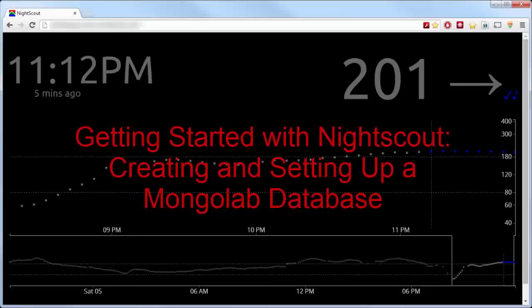Nightscout is an open source project that takes data from a Dexcom CGM and sends it to the cloud where it can be accessed by diabetics and the people that care for them.